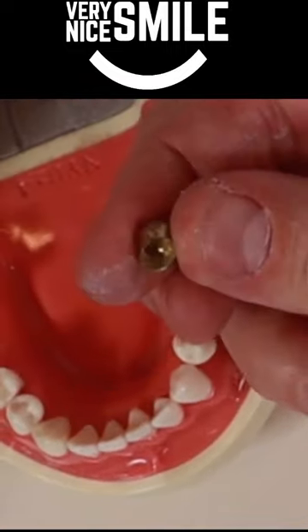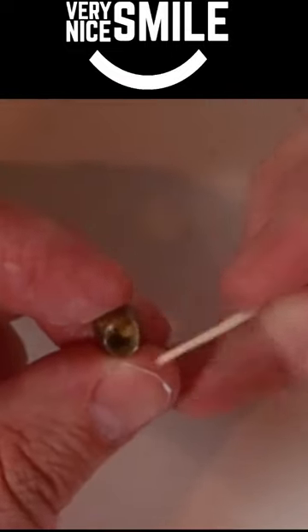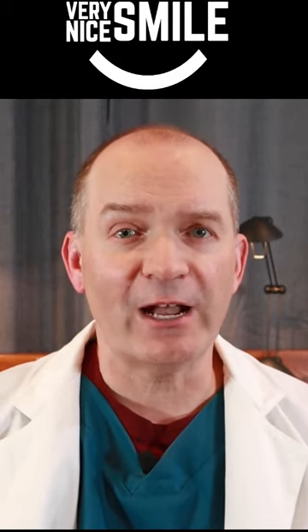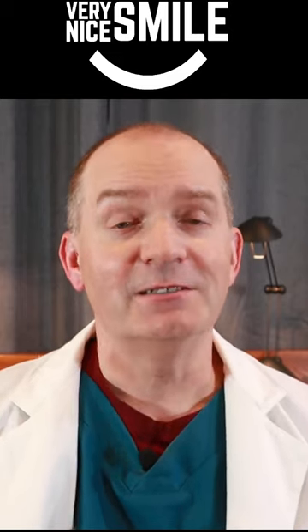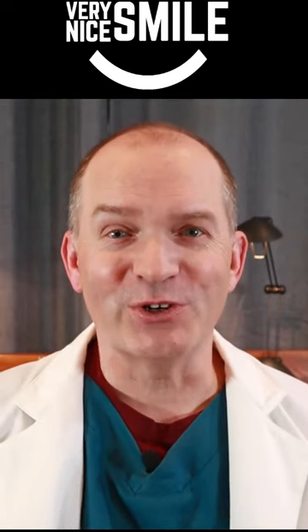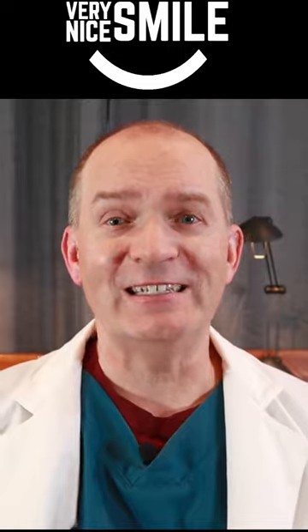To re-cement a crown or bridge that fell out, first try to clean out any food or plaque that might be stuck inside the crown. Then take the crown and test fit it on your tooth. Does it fit and feel okay when you bite down on it? Good, then you can try and re-cement it. Dry off the inside of the crown.